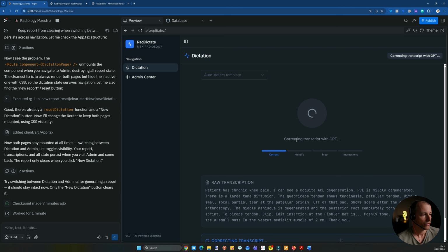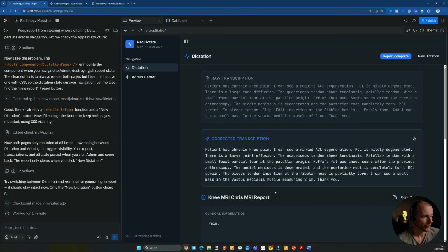So I was just adding a few things to make it harder. This is now bad. Like, I think it struggles if it's not a proper fluent dictation. Large joint effusion, quadriceps shows tendinosis, patellar tendon with small focal partial tear, Hoffa's fat shows scars after previous arthroscopy, meniscus tear. Sprain, biceps tendon fibular head, partially torn. I can see a small mass in the vastus medialis. Okay, that's actually good.